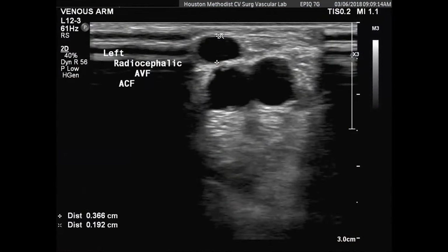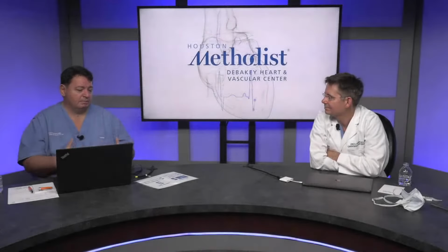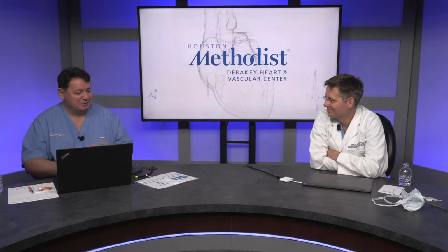Well, this was our study, and thank you for helping me to interpret this, and thank you so much for your lecture and teaching us. When I'm interviewing sonographers coming out of school, it looks like AVF is still not covered along with TCD. That is really a lack of experience, and this is where we have to continue to teach our sonographers and also our students.